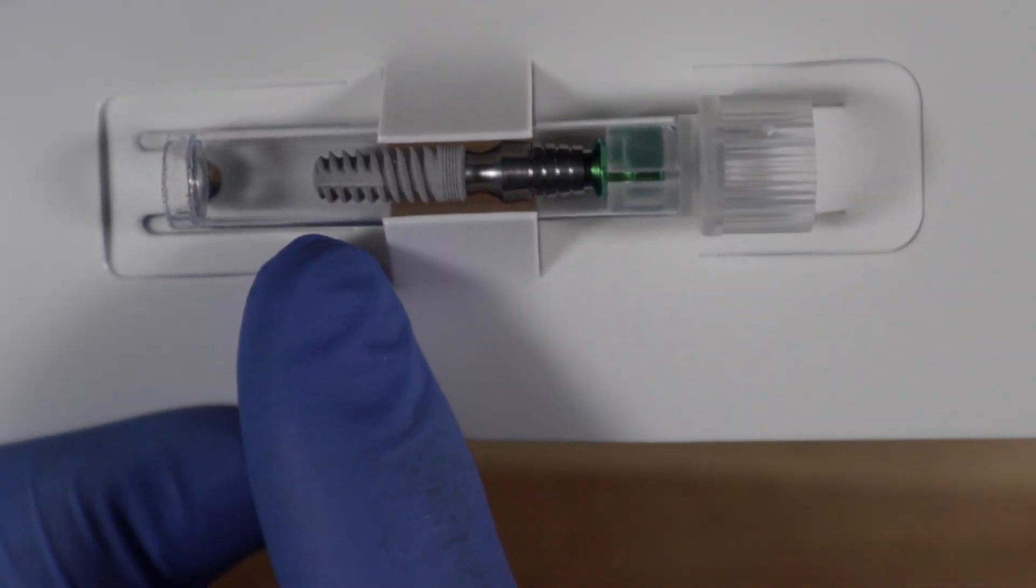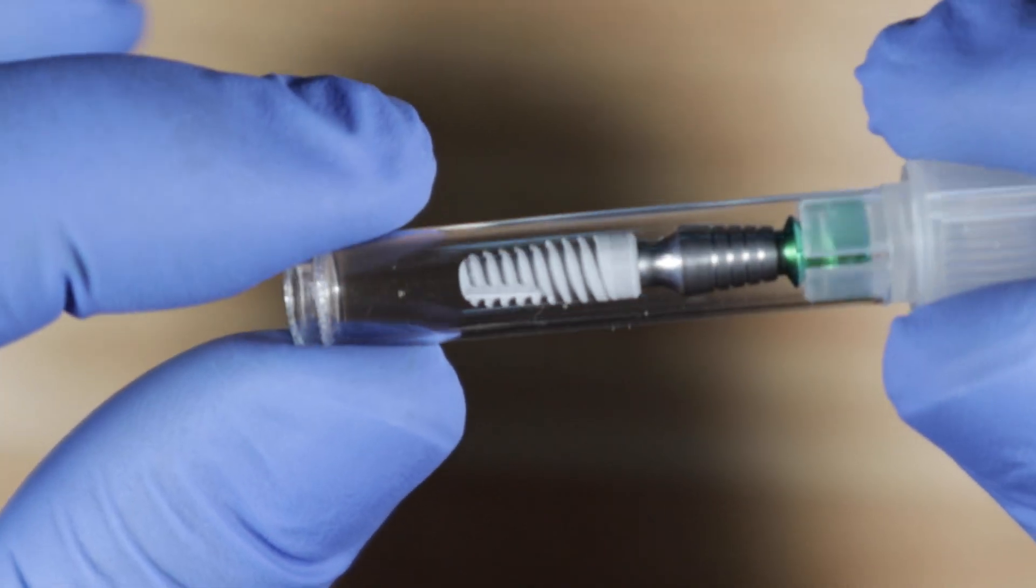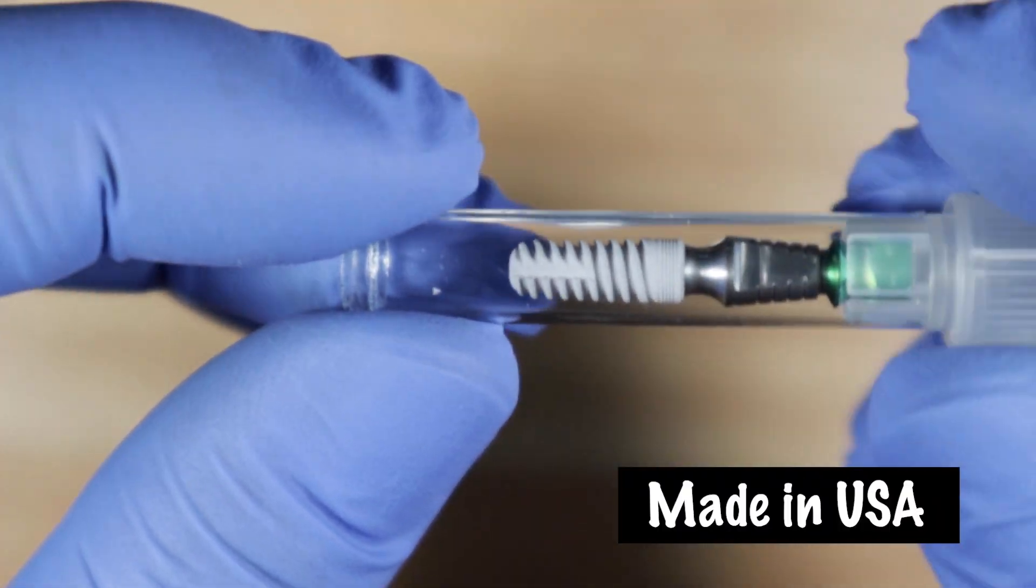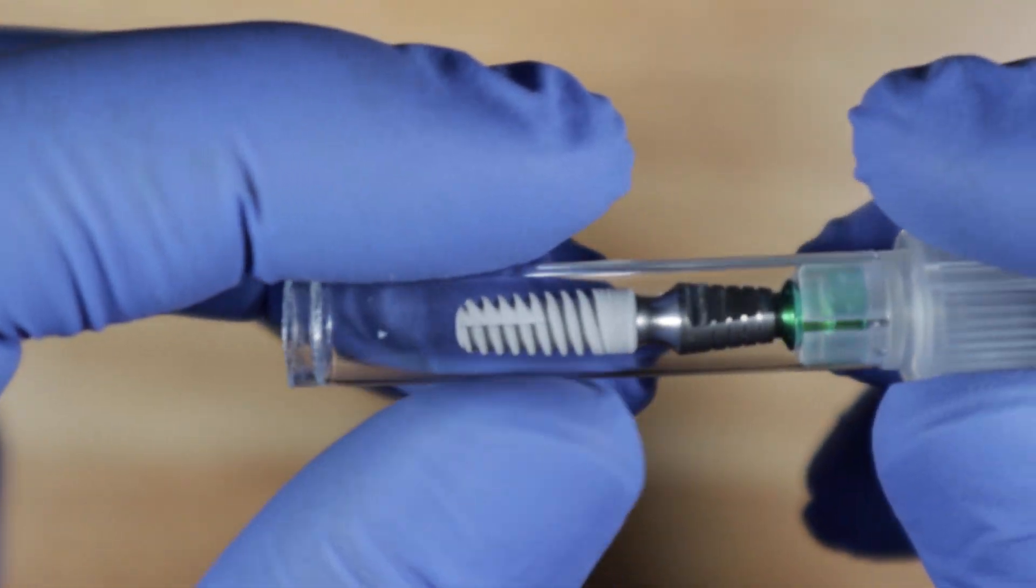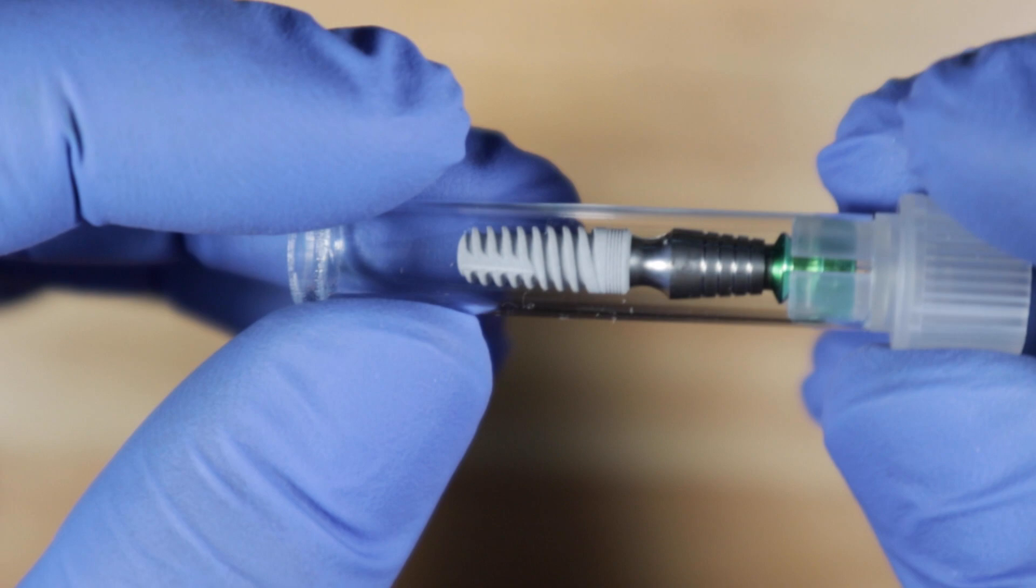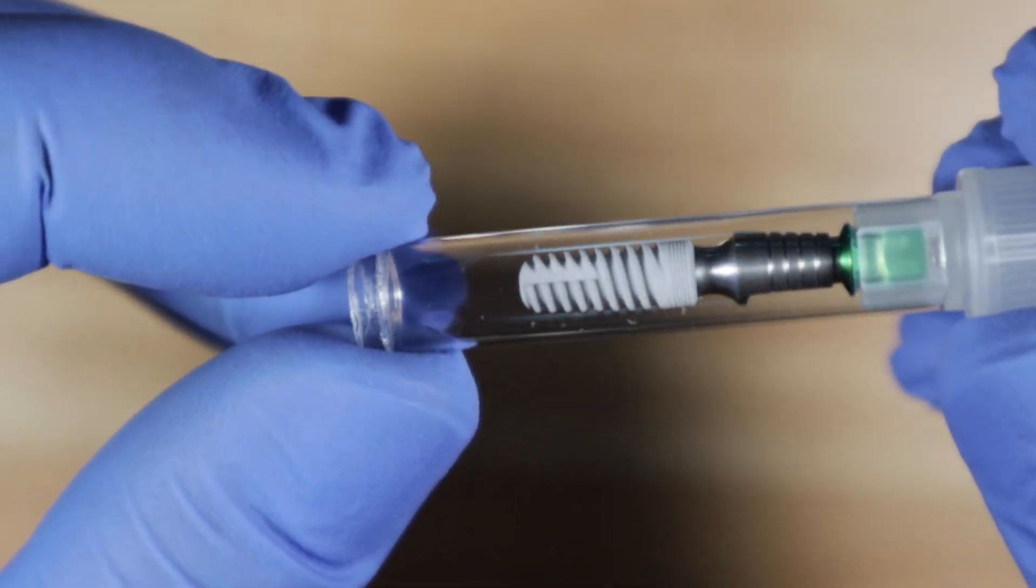Now first let me go over some of the specs of the implant. Let me pop it off of here. So this little screw is made in the U.S. And there's a couple of key things that I look for when we're talking about a dental implant, when you're trying to pick a good dental implant to use. So let's go over those main things right now.